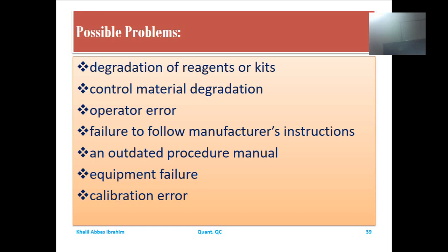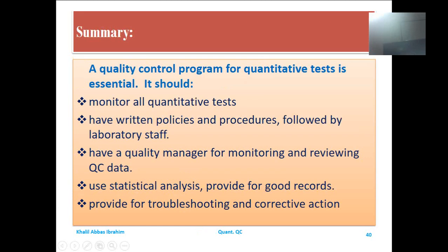Or sometimes no calibration takes place at all, and if you don't calibrate your system, your reagents, your analytical system in general, then you wait for major problems to take place in your laboratory.